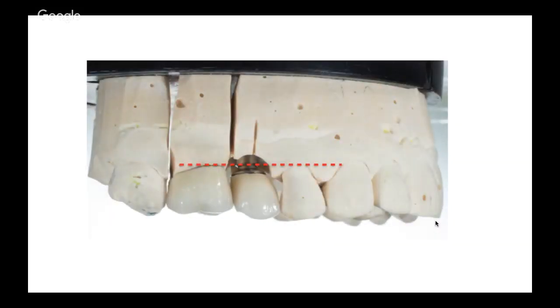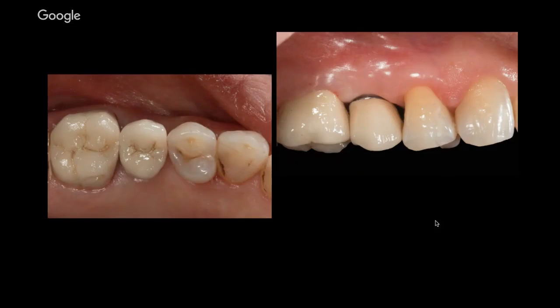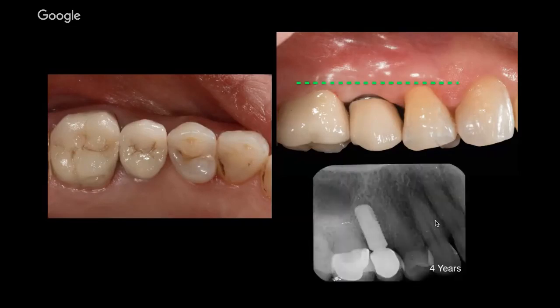Unfortunately, the crown we made has an insufficient crown length compared to adjacent teeth. In the mouth, this aesthetic problem strikes the eye too. Our only solace is that the crown we made according to the rules would stay in the mouth and preserve the bone for long years. But the patient will not have a papilla. Never. Please never forget the rule of 3 millimeters.